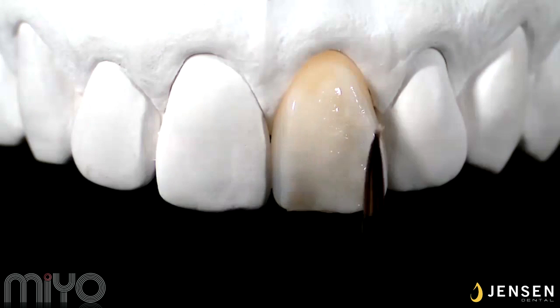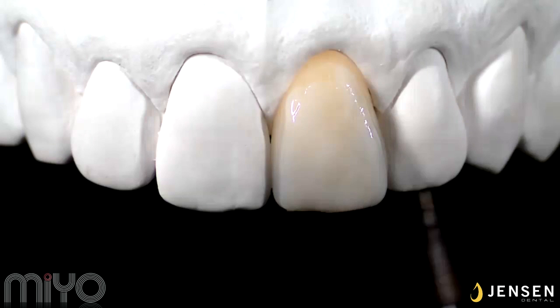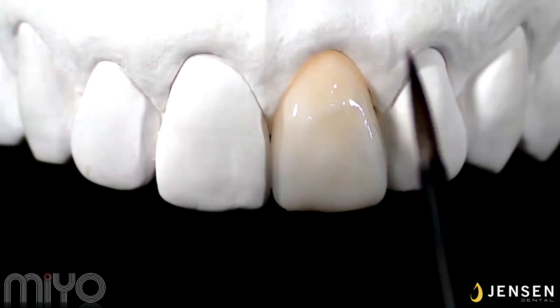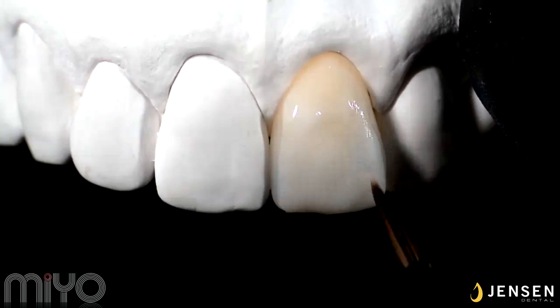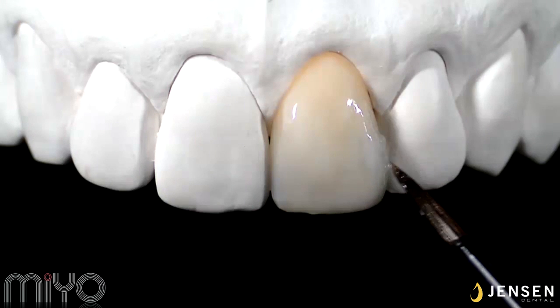As you see here, all my final form and surface texture will be formed prior to my structure firing cycle. You never have to worry about moisture control with MiYO. You can even have the material out in the open for several days and the moisture will still be apparent. Onto my final stage before firing my structure material. I usually flatten out my brush like a fan and create my final texture, my fine texture like your perikymata. If you're not happy with it, you can simply condense the material and start over again.